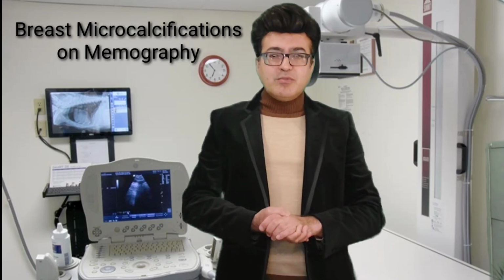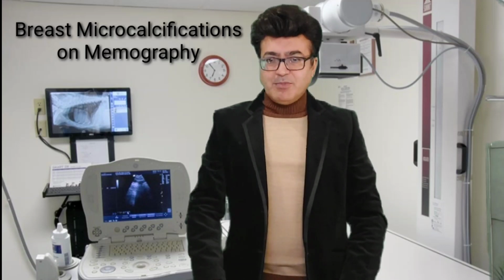High histology grade ductal carcinoma in situ will give rise to a comedo calcification, or casting calcification, and low histology grade ductal carcinoma in situ will give rise to a cribriform pattern on the mammogram images.